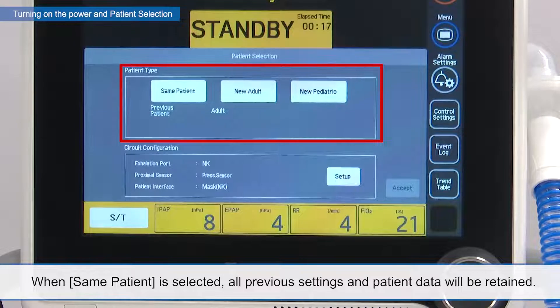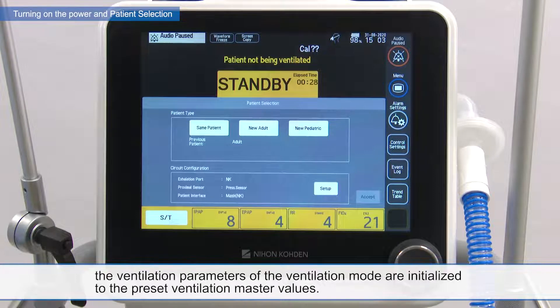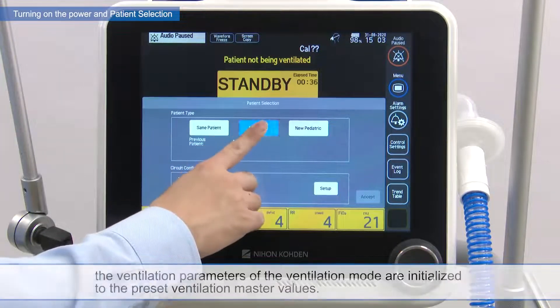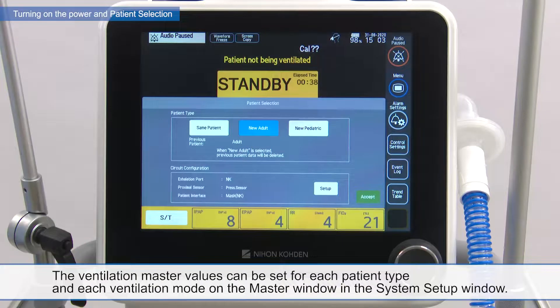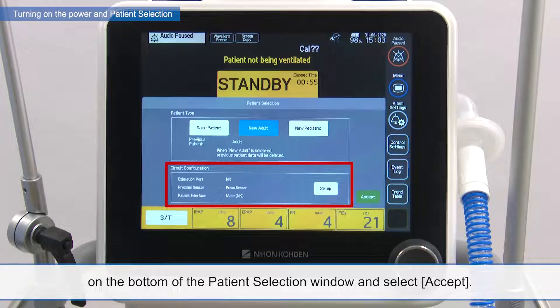When same patient is selected, all previous settings and patient data will be retained. When new adult or new pediatric is selected, the ventilation parameters of the ventilation mode are initialized to the preset ventilation master values. The ventilation master values can be set for each patient type and each ventilation mode on the master window in the system setup window. Confirm that the same circuit configuration is used as shown in the circuit configuration settings at the bottom of the patient selection window, and select Accept.